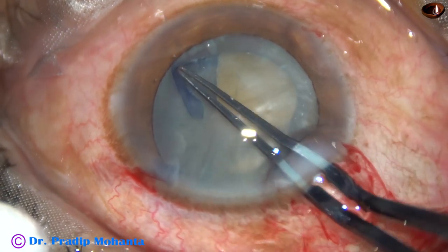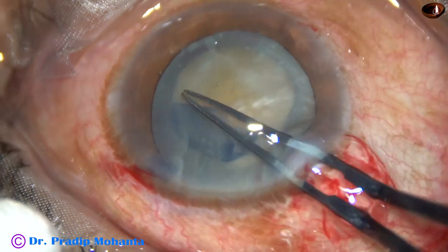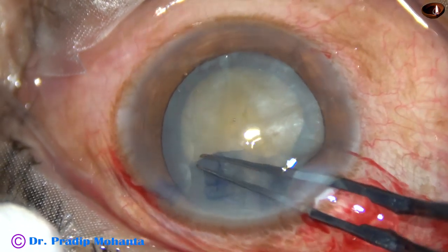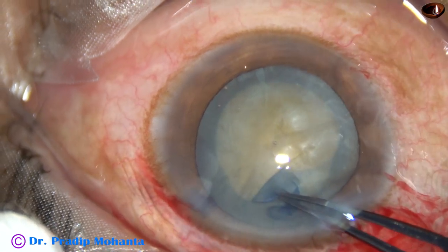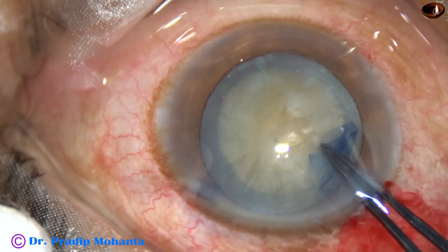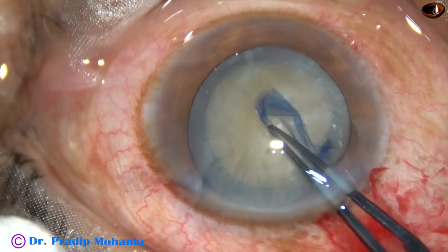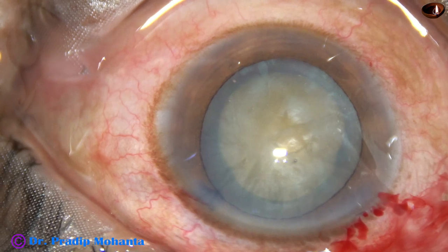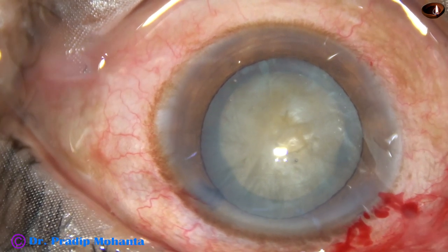No turbid fluid coming out, so this is not an intumescent cataract — this is a non-intumescent cataract. So I am doing capsulorhexis on-the-go. However, there is some convexity in such cases, and we have to be careful about how to control and guide the capsule flap.